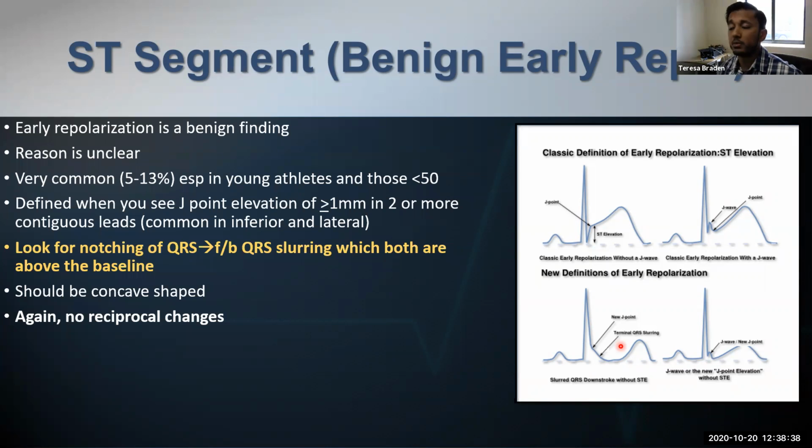Since I'm the CSU Pueblo team physician, I'm seeing this in our patients, but the times that it really concerns me is in the COVID era. If they had any exposure, we can see that, and it's not benign or early repol. It could be true damage that's happened to the heart secondary to COVID. So COVID's definitely thrown a curveball for multiple reasons. And those in general, less than 50, it's not uncommon to see this.